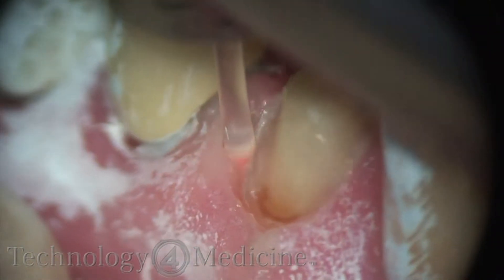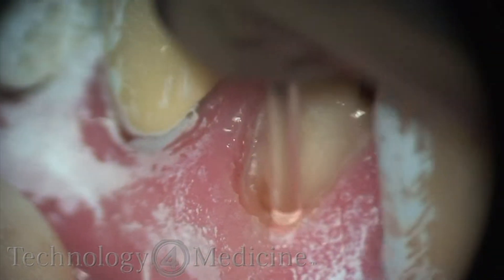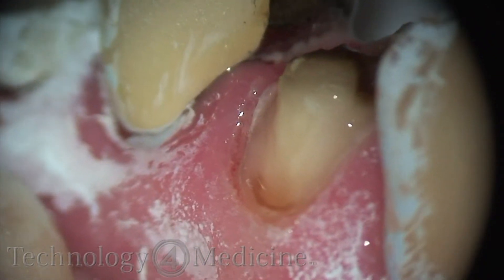I'm going to create a shoulder here, and what I'm going to do is remove the tissue and trough around my margin to expose my margin, so I get a nice read by my computer.